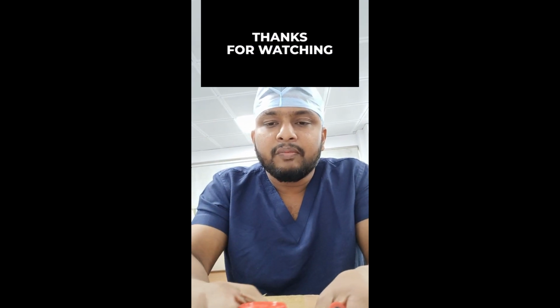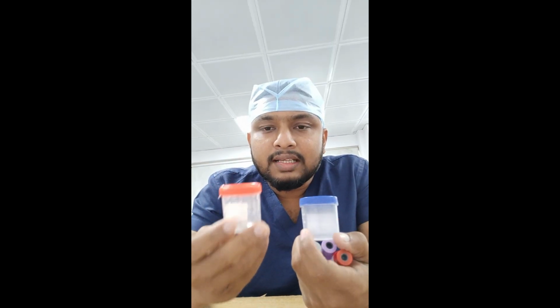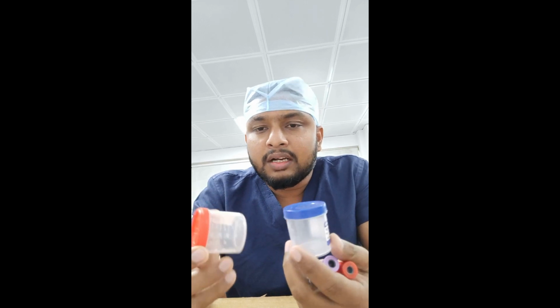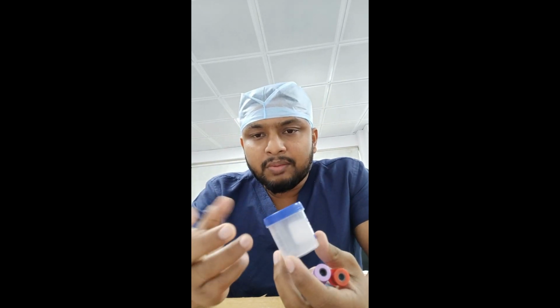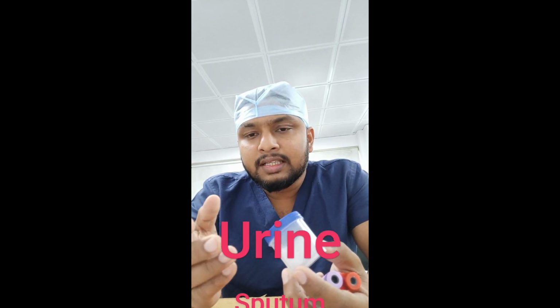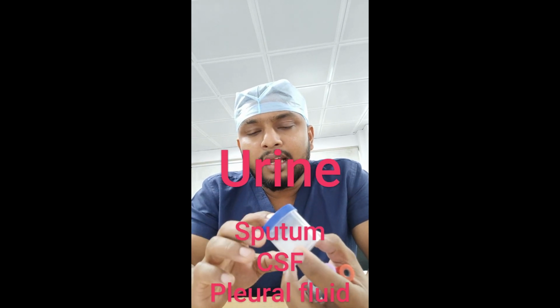Along with blood, if you want to send any urine samples or body fluids like CSF, pleural fluid or ascitic fluid, any type of fluid, you can send it in this type of container. Whatever the color, whether blue or red, it depends on the organizational policy, which type of container they procure. You can send urine, and sputum for analysis like sputum AFB, gram stain, culture, fungal stain, and BAL samples.